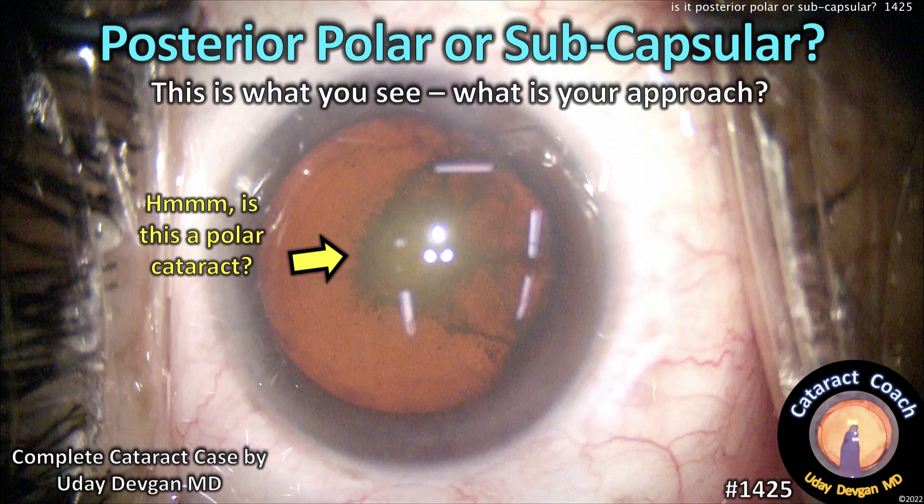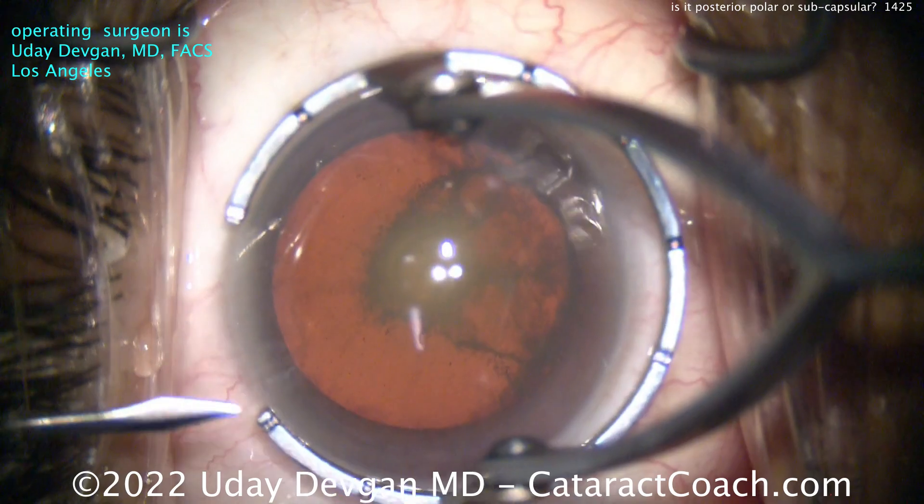cataractcoach.com. Post your polar or posterior subcapsular — this is what you see. You tell me now: what's your approach?